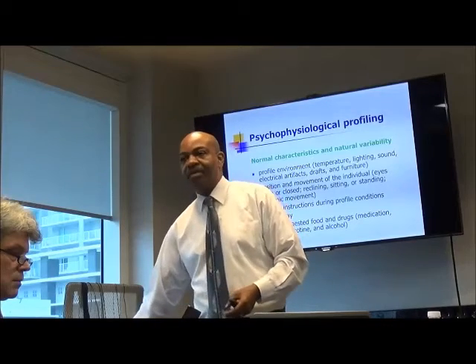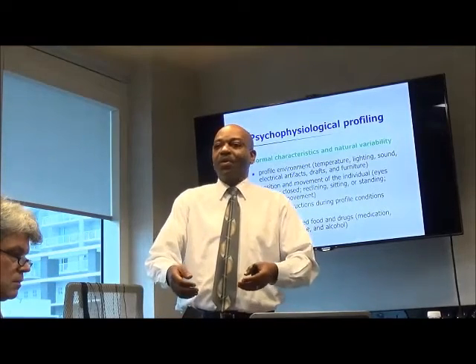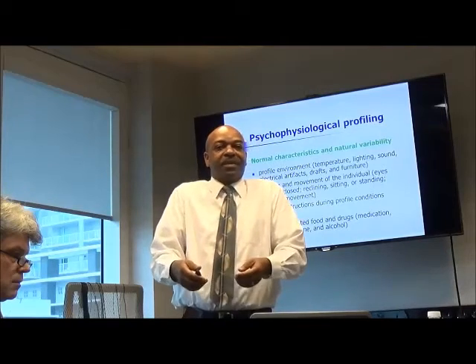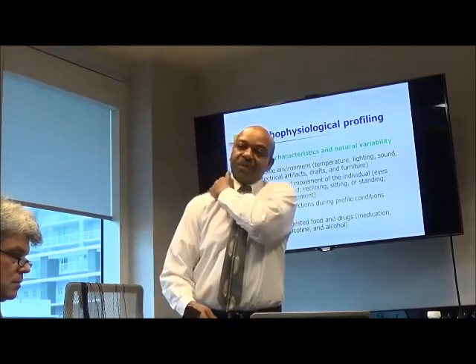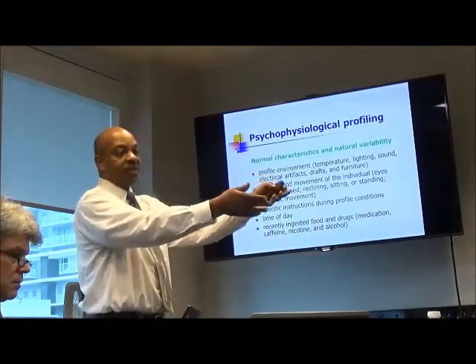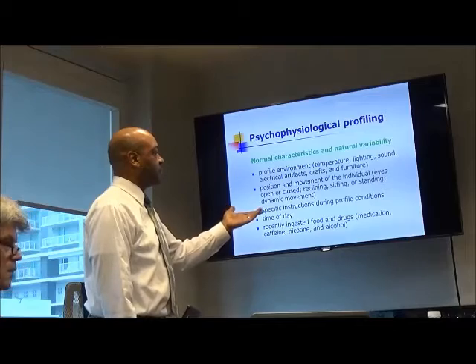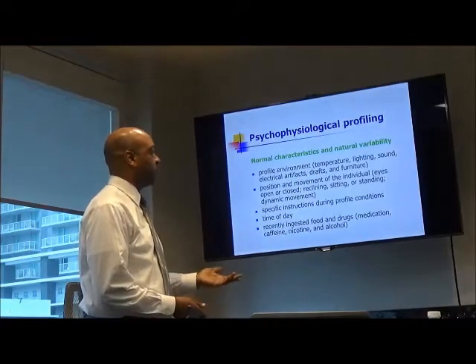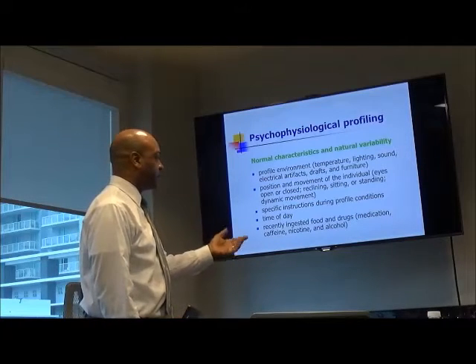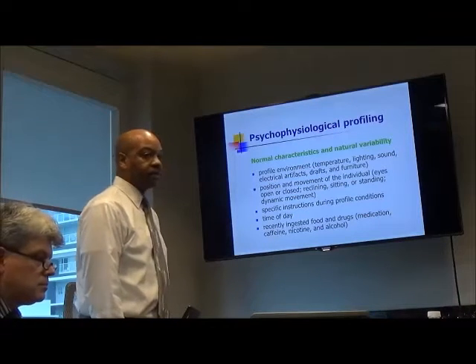Or sometimes even the way that the armrests are, and depending on the person's body, it may cause them to hold some extra tension. Let's say the armrest is too high or something, and they feel like they're doing this, so you might be picking up extra tension just because of the furniture, or if they have to look at a screen, where the screen is, that could also cause issues. Position, movement of the individual, eyes open or closed, whether they're sitting, standing, reclining, all of those things can affect the readings. Even the time of day can have an effect.